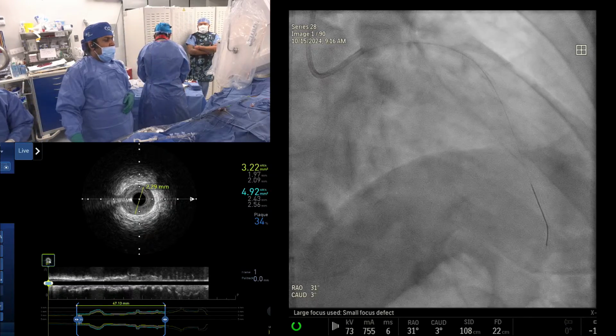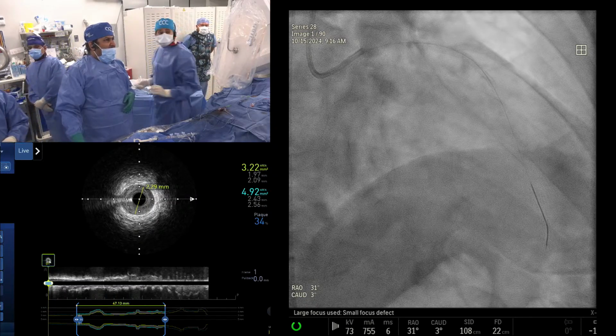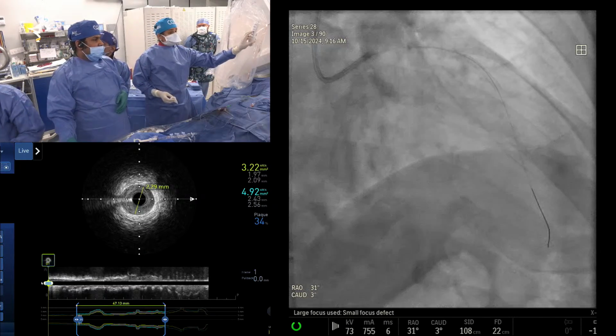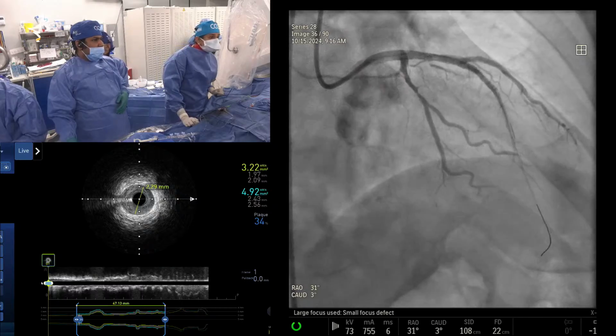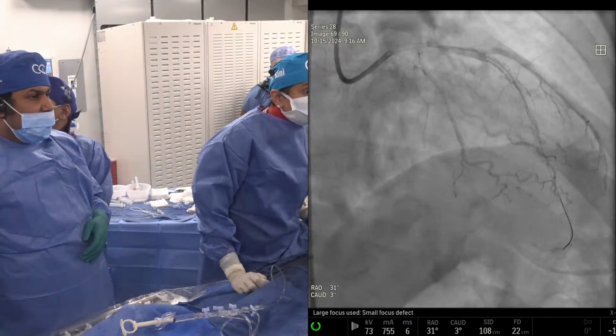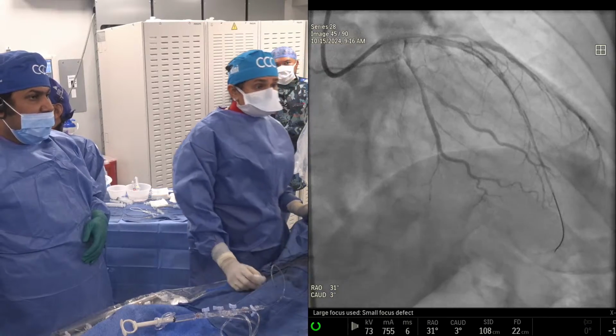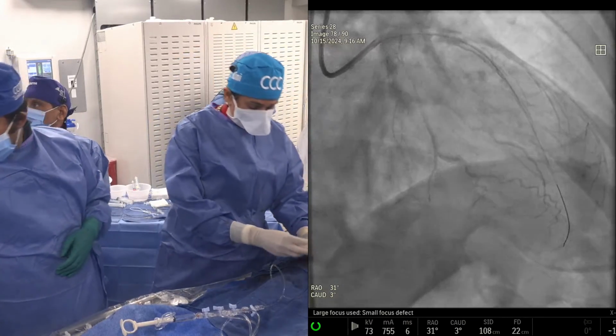So, the little haziness which you see more at the end of the angiogram, you think that's just flow related? I think it's just the last end part of the flow which shows you some haziness. There was nothing on IVUS either. So we have a good confirmation.